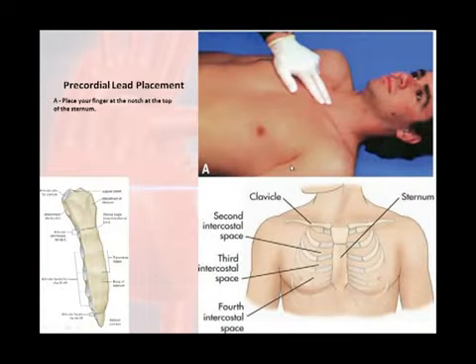So we're going to go ahead and discuss placement. Now, it's very important that you follow the proper placement procedures. A lot of people have asked me in the past, do you actually put these electrodes exactly where you're supposed to? And my answer is, if it's possible for me to place these electrodes exactly where they're supposed to go, I do it every single time.